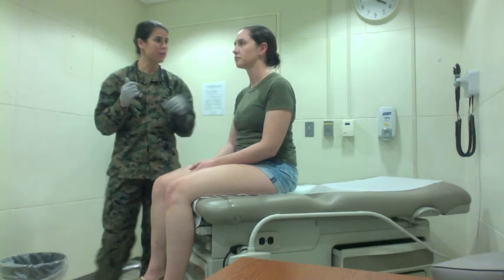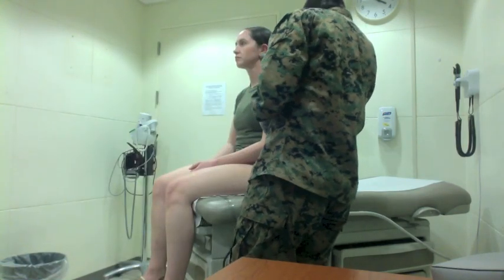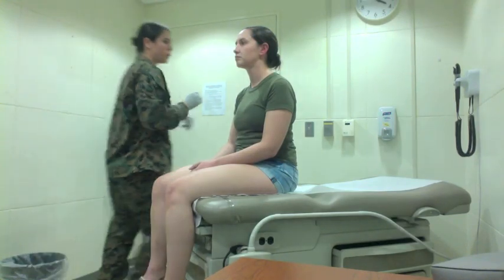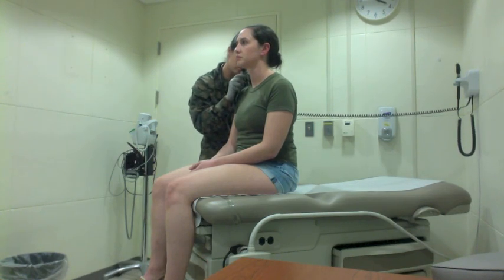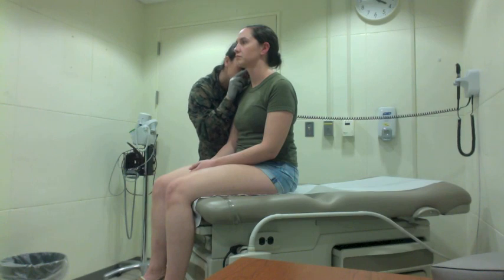Everything looks symmetrical, healthy tissue. Skin again is normal for race. Skin is warm. I am going to look inside. Tympanic membrane looks healthy.